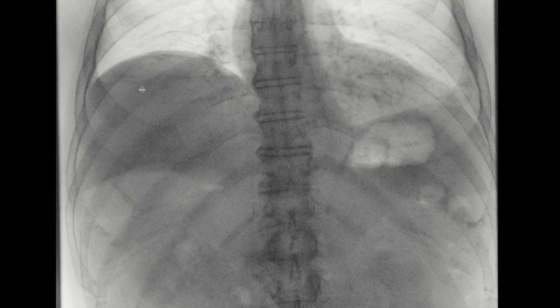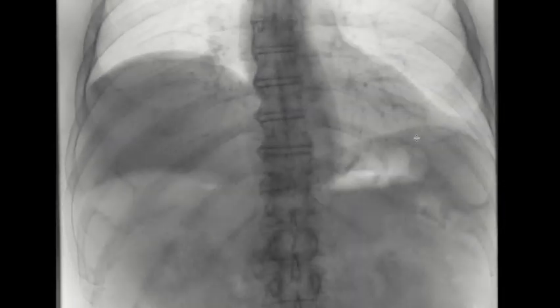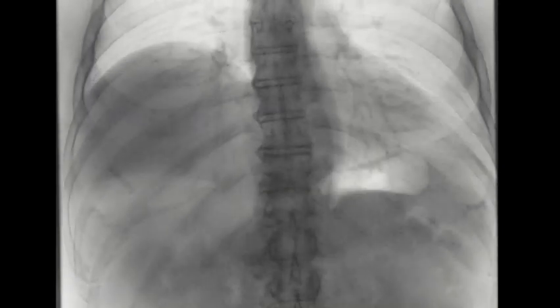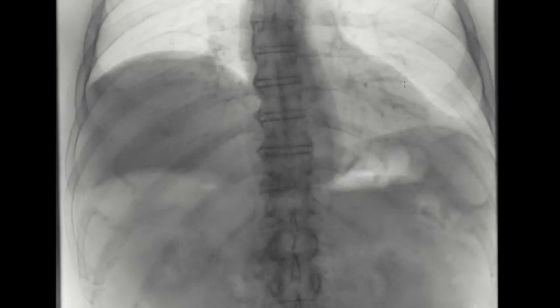This is a patient with right hemidiaphragmatic paralysis. As I scroll through, note how the right hemidiaphragm is not really moving. If you pay attention one more time as I scroll through, you'll notice it's not really moving — contrast that with the left hemidiaphragm, which is moving.